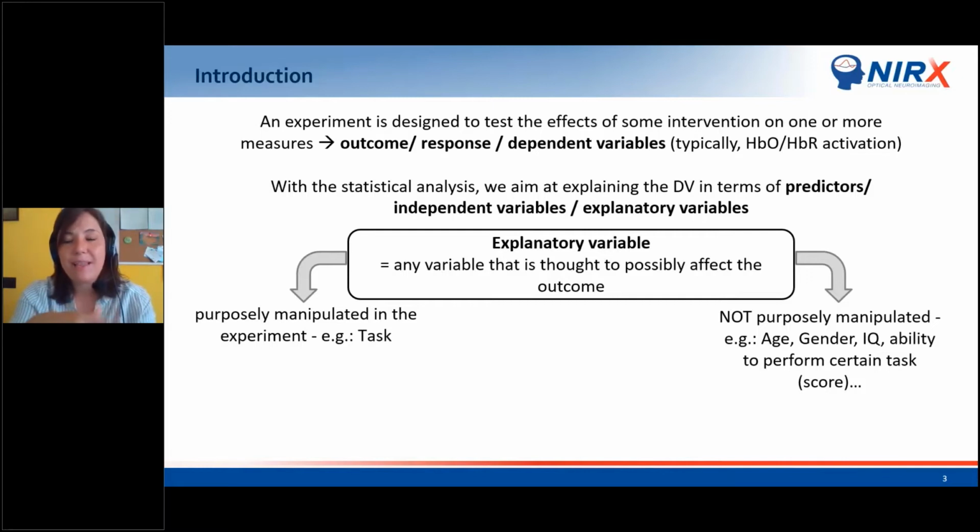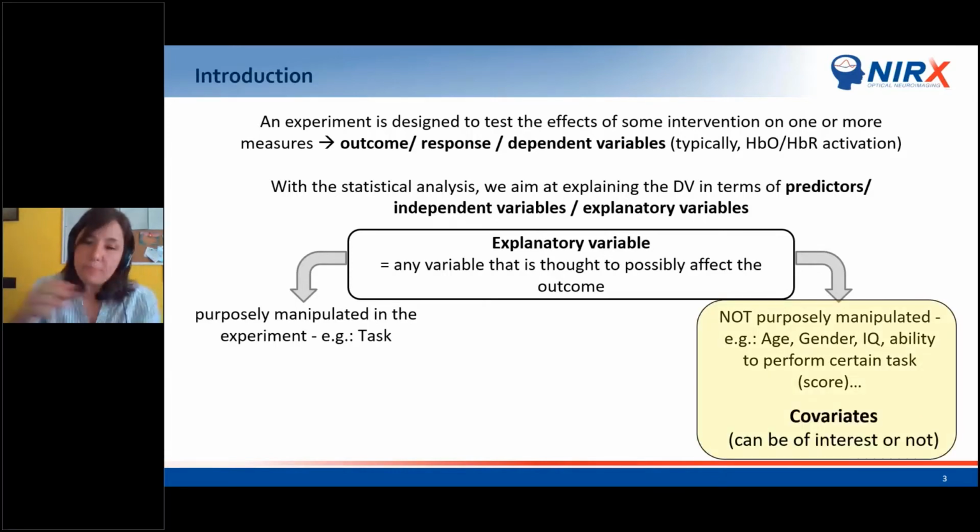But as much as we'd like to rule out variability and we'd like our sample to be really homogeneous, there are going to be inevitably some differences between the participants. So the goal of including this information in the analysis is really to, first of all, control for it.